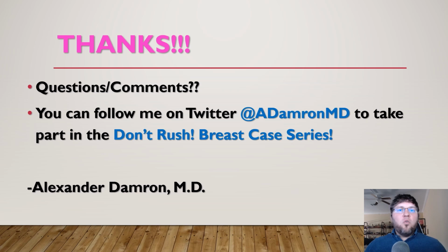You're having to decide on core biopsy what you think needs to be excised versus what doesn't. So I hope that I gave you some practical approaches that I use, and I hope that you find it helpful. I hope everyone enjoyed this. This is something I put a lot of time and effort into, so I hope that you found it helpful.